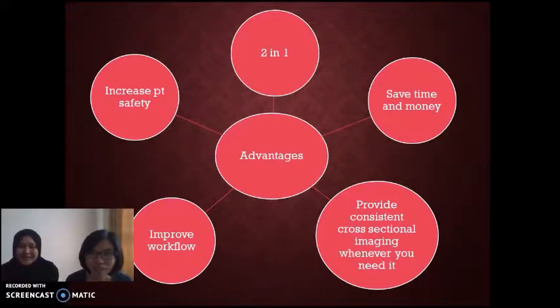Next advantage: it saves time and money. In terms of saving time and money, it is more towards the patients because it can reduce the time of the procedure. Previously, the patient needed to undergo two modalities separately, probably not on the same day. But now with the angio and CT combination, the patient can undergo two modalities at the same time. Next, for the workflow, it can improve the workflow of the radiographer, more effective and efficient. Lastly, and most importantly, it can increase patient safety.